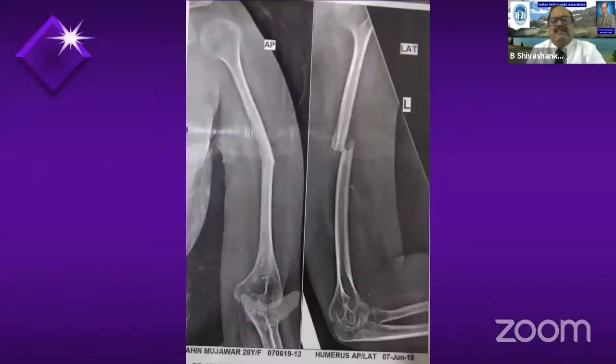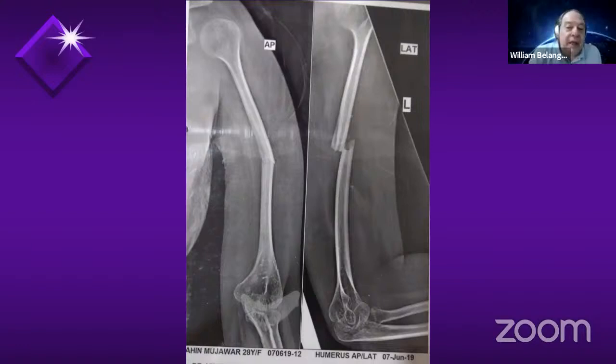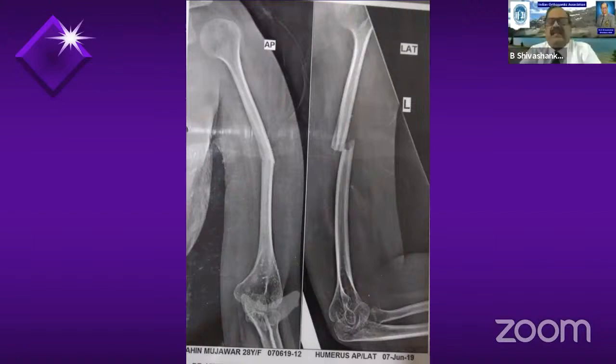Okay, thank you. This is a very narrow medullary canal. Can you do, Belangero, what you can do in this patient? Well, if I indicated surgery for this patient, I think we can use MIPO technique. I take care to use a long plate, 12 holes, or I need to measure, but a long plate. And in this case, I think it's very important to put 2 screws, leaving an empty hole between them, to avoid fracture.